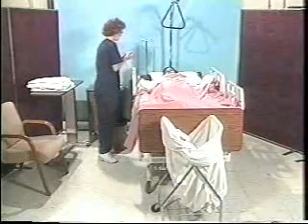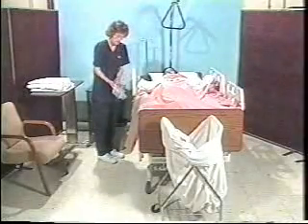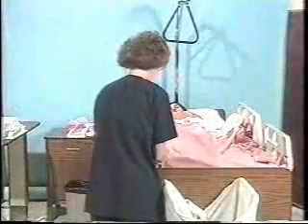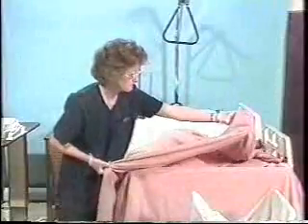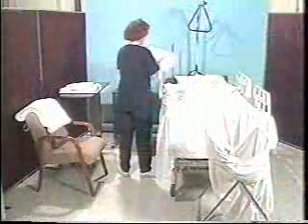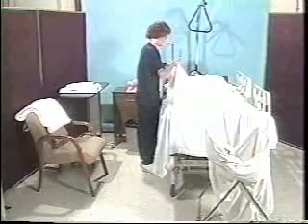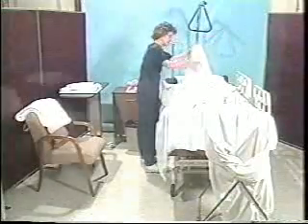She applies the glove if she suspects that the linen has been soiled with blood or any other body fluid. Then she loosens the top linens at the foot of the bed. Because the caregiver is going to reuse the blanket and bedspread, she folds them and places them over the top of a chair. Before removing the top sheet, the caregiver covers the patient with a bath blanket, which will keep her warm and provide privacy during the procedure.